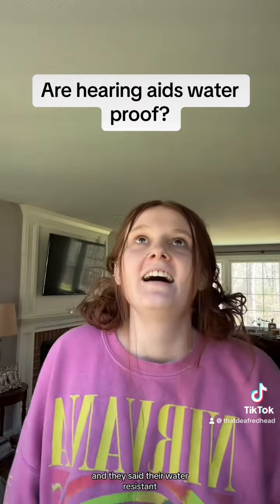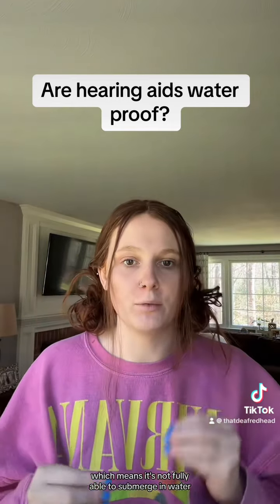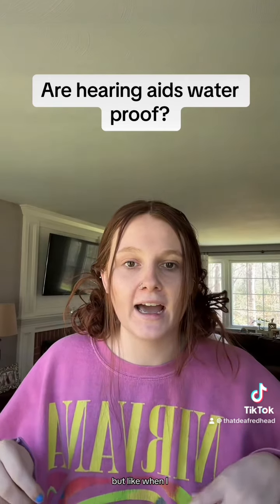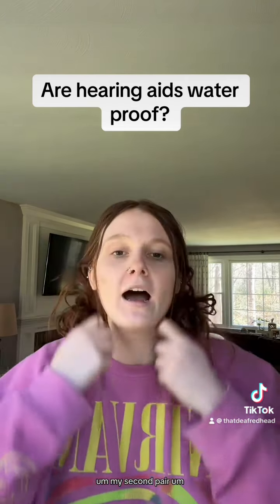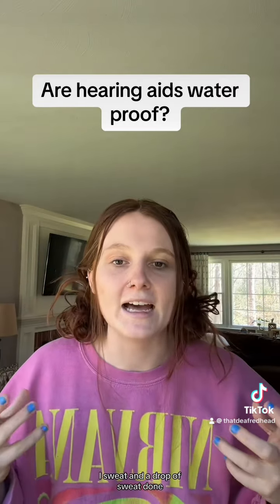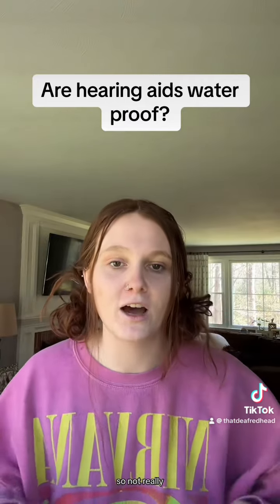And they said they're water resistant, which means it's not fully able to submerge in water. But like when I was in high school, that's when I got them, my second pair. Like I play sports and basketball, and like I sweat, and a drop of sweat, done. Can't hear a thing. So not really.